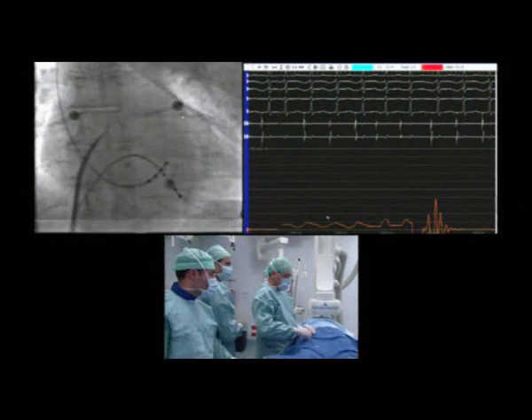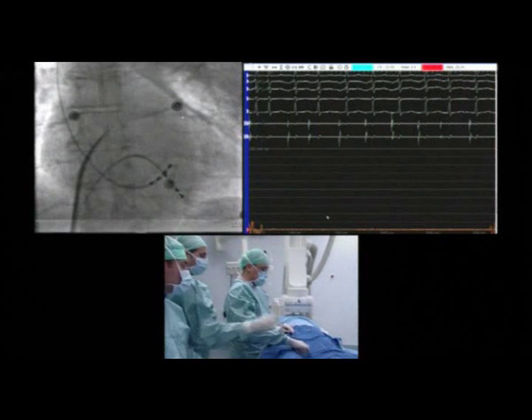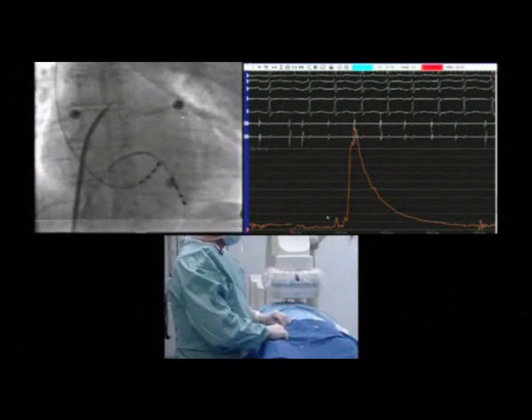The needle and sheath are pushed in without hesitation. This puncture is followed by the recording of left atrial pressure. The sheath is then pushed into the left atrium while the needle is retracted.